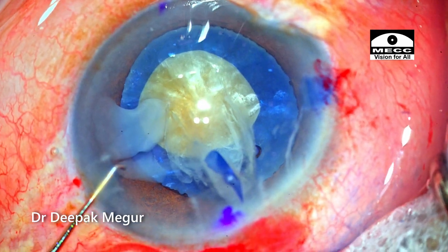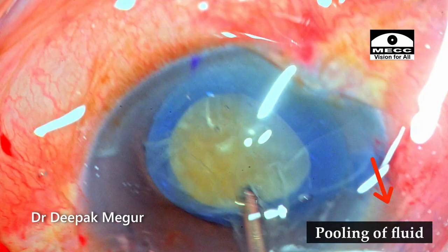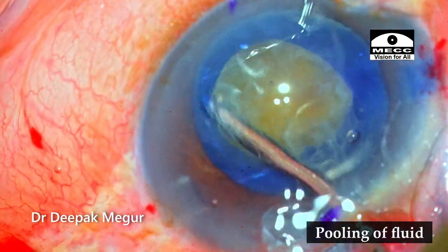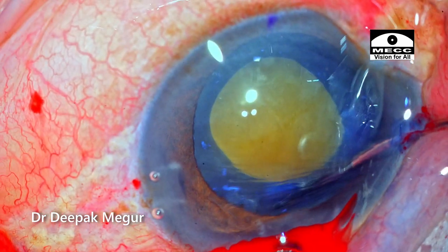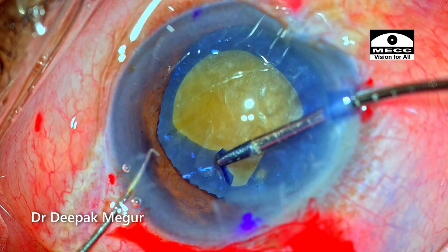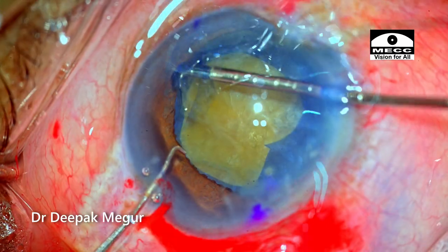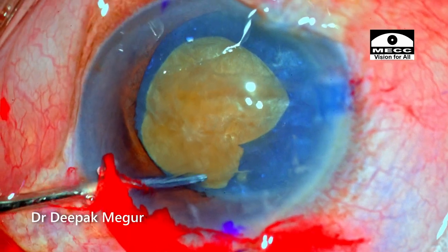The plan is to do a secondary larger rhexis. Before that, I am irrigating out the loose cortex so that I'll have good visualization. The OVD is refilled into the anterior chamber. Using micro-scissors, a tangential cut is given to the anterior capsule, and holding that flap is used to give us a bigger and wider secondary rhexis. The enlargement is done from the other side as well.